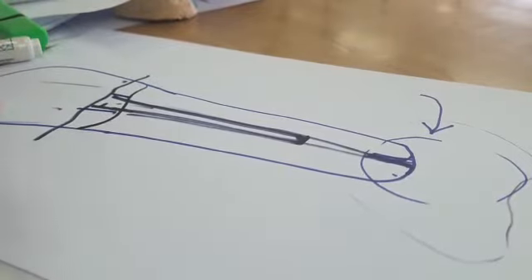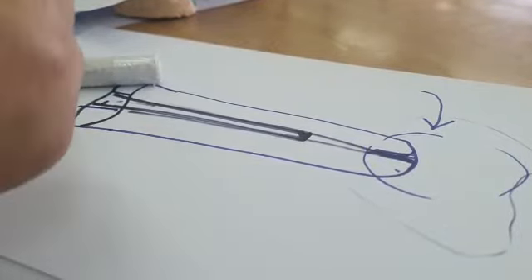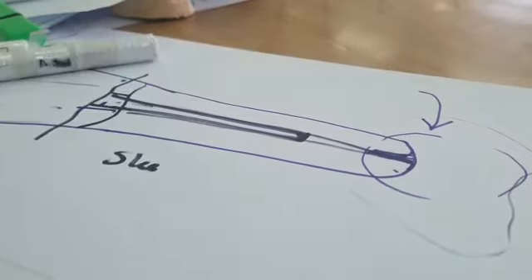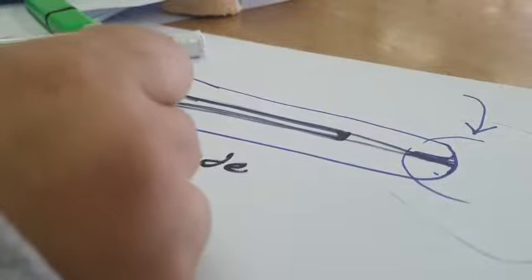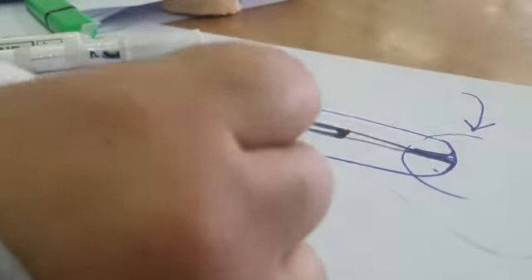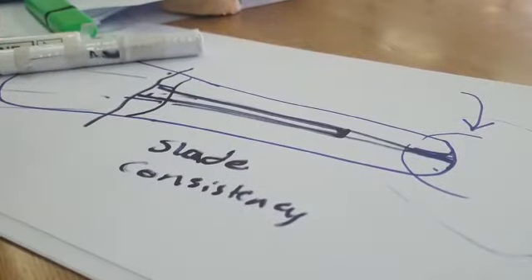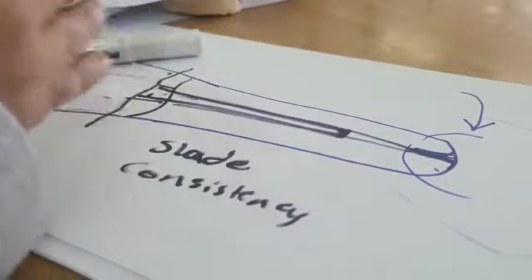Drilling through. First of all, the problem with drilling through dentine, fiber posts and dentine, is that the fiber post and the dentine have sometimes the same shade, or even the same feeling and consistency. You don't know when the bur is moving between the dentine and the post. They almost feel the same to the drill. Okay, because we're depending on our tactile sensation. Okay, you can see it 1 to 2 millimeters from the orifice, but after 2 millimeters and the bur is inside, you don't see anything.